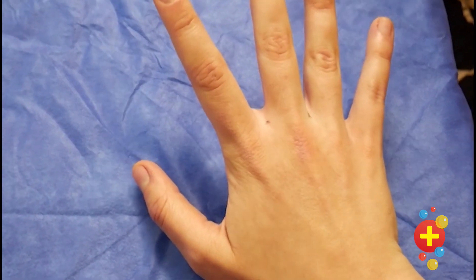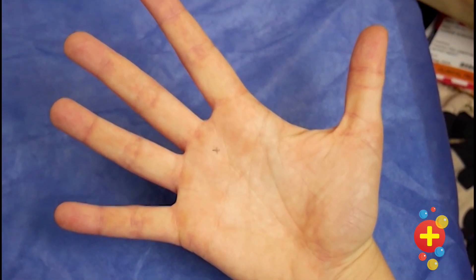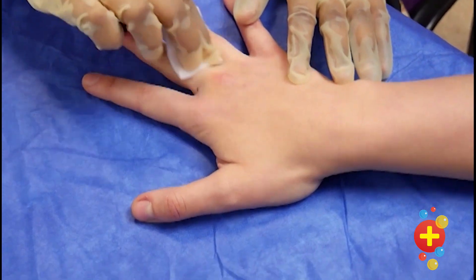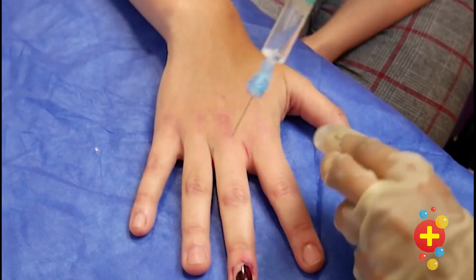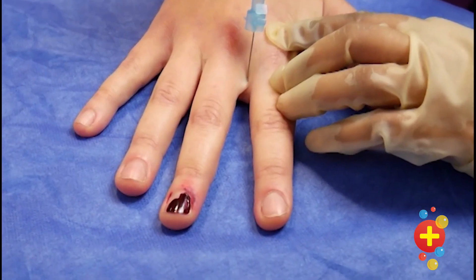For the palmar approach, first ask the patient to flex their finger to locate the flexor tendon, then go one centimeter lower than the finger crease. Clean the area before you inject. You'll be making two injections either side of the finger that needs to be anesthetized. Insert the needle at 90 degrees and aim for the palm of the hand, making sure you don't go all the way through — aspirate as you go.